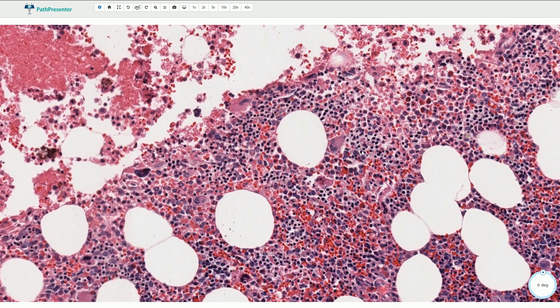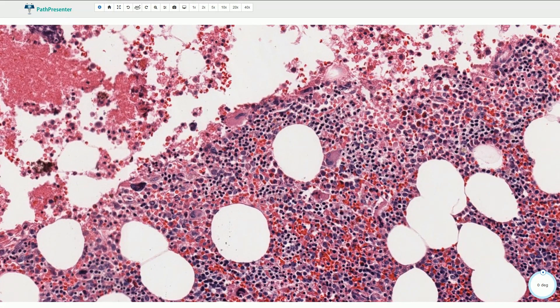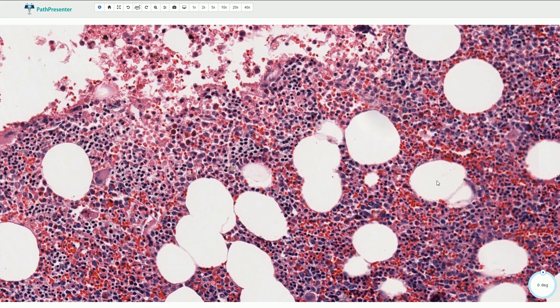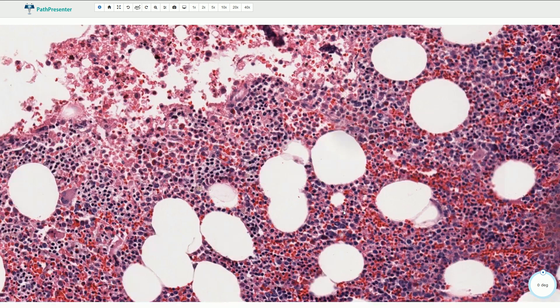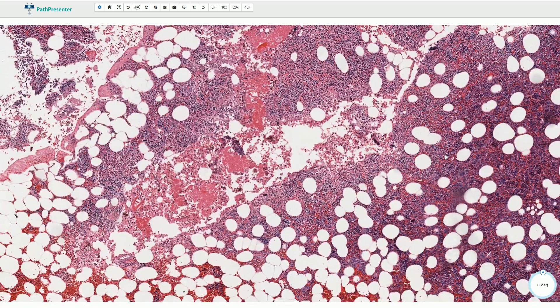We also have the erythropoietic component — cells with perfectly round dark nuclei — and then all the other cells with granules in the cytoplasm and slightly lobated or irregular nuclei, which represent granulopoiesis. So we have all three components of normal hematopoiesis, and it looks like we are looking at bone marrow rather than a tumor in the adrenal gland. This is the characteristic appearance of myelolipoma.